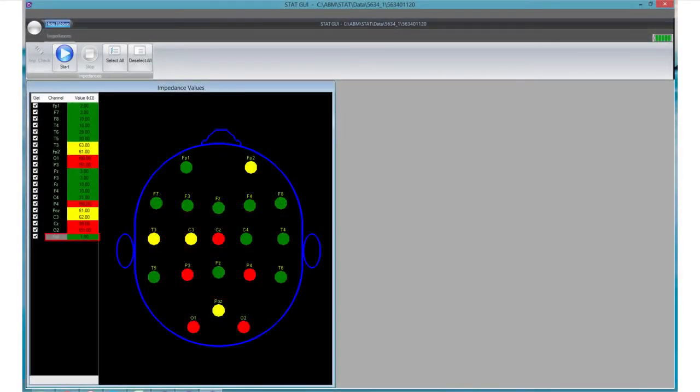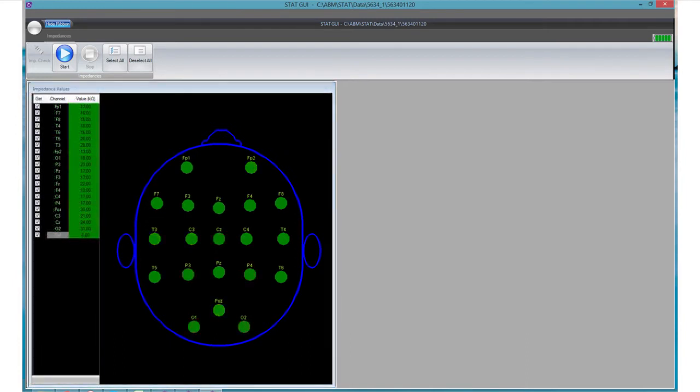Reference impedances are measured at the mastoid bone site. If the reference channel in the impedance check is colored yellow or red, it will negatively impact all channels. In order to proceed with data collections, we recommend that all impedance channels, including the reference, are lower than 40 kilo-ohms as indicated by numerical values and green impedance coloring across all EEG channels.